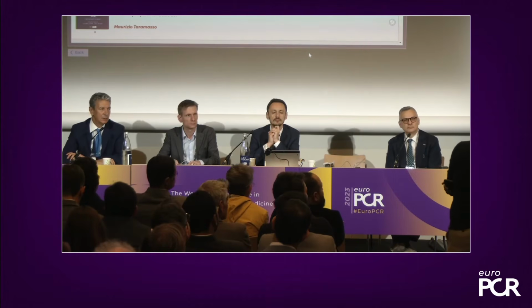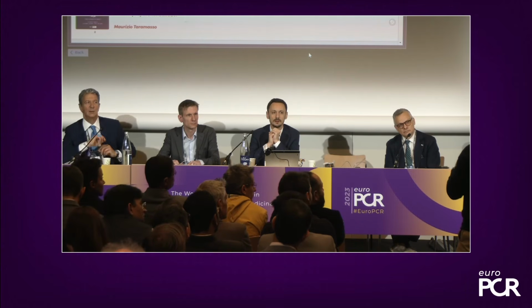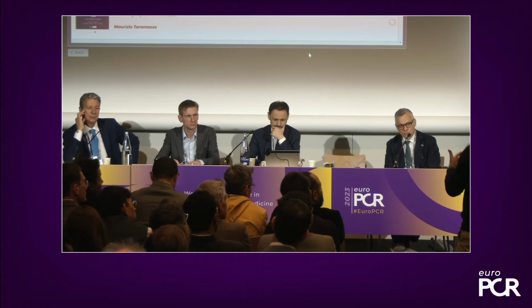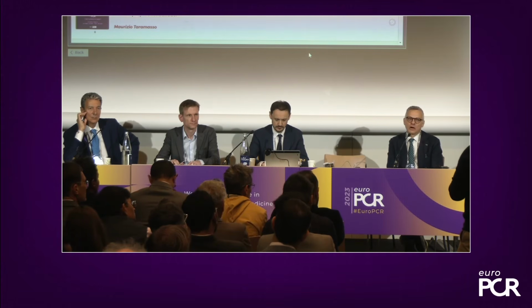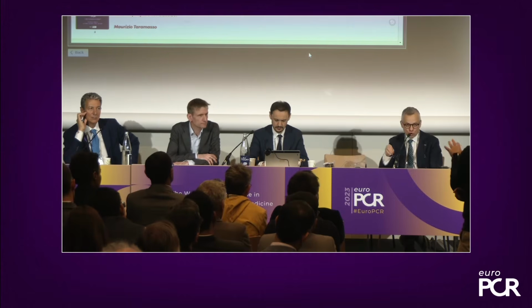Please. It's Dimitris Nikas, Ioannina University, Greece. If I quite understand, you pull both strings together the first time when you close, so you don't close one after the other. Because what we notice is sometimes even one ProGlide is enough to close the artery, and the second one may close the artery completely. That's why we did it. Actually, we do the first one, check the artery if everything's okay, and then the second ProGlide can close the artery completely, this happens sometimes, especially in tortuous arteries. We just cut the ProGlide. We have another one ready if needed, with the wire inside. But should we do this? So one after the other? Closing completely means that you have complete occlusion of the artery. Well, completely.